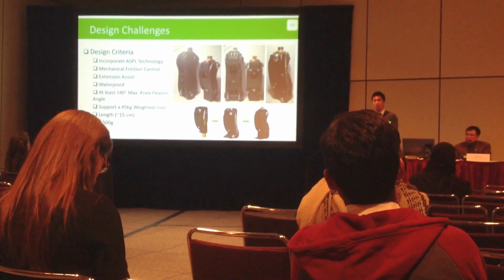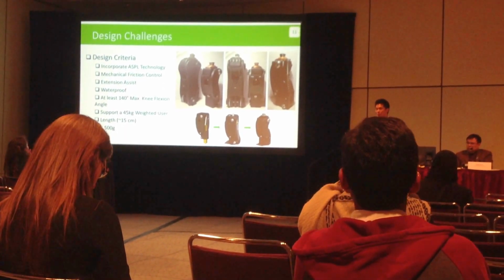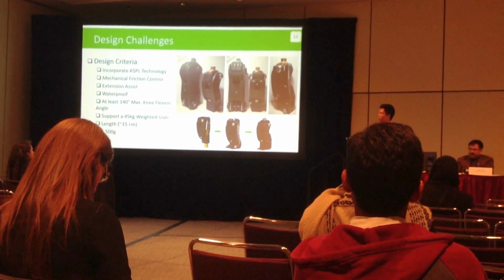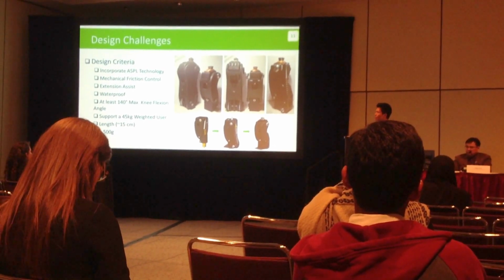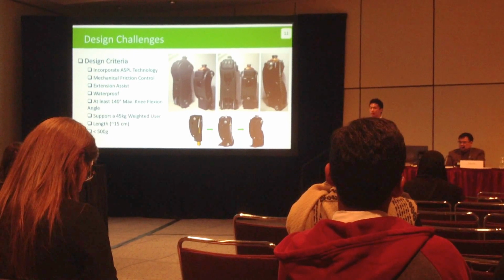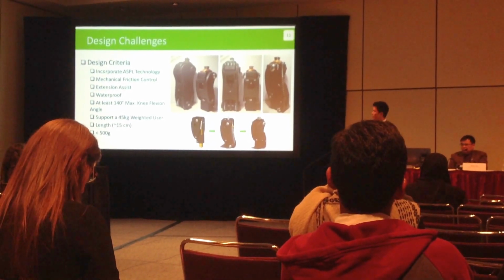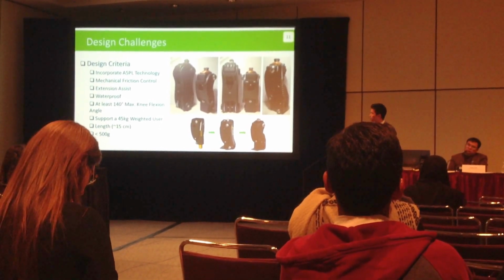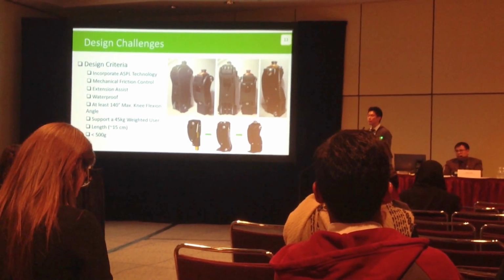So what are the design challenges in stage 1? The design challenge is trying to incorporate all the design criteria listed here. We're trying to incorporate the ASPL technology for stance phase control, and incorporate friction control and extension assist for swing phase control. At the same time, we're trying to keep the knee lightweight, compact, and structurally sound.